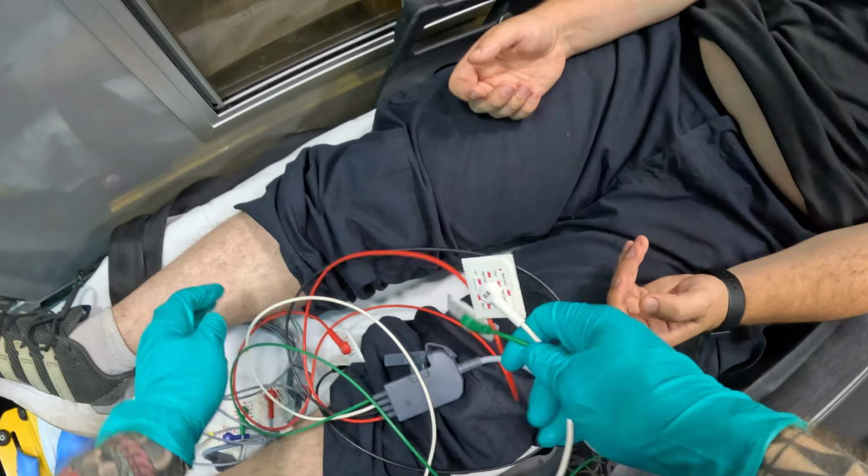Once it's finished printing, make sure you wait until it's fully finished. The way you're going to remove it, you're going to grab it here and pull down. Do not pull towards you or up, because you may tear it at the center. So you pull down like that. Then this is the rhythm strip, and this is the 12 lead EKG that you're going to present to your paramedic.